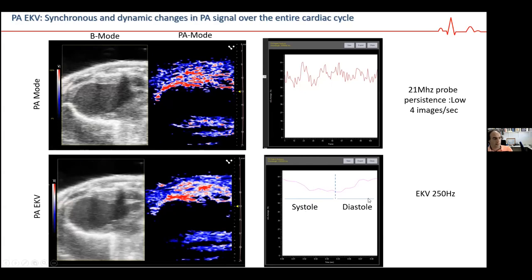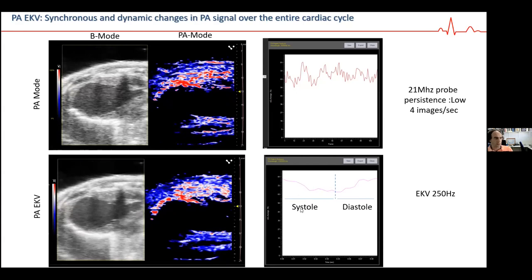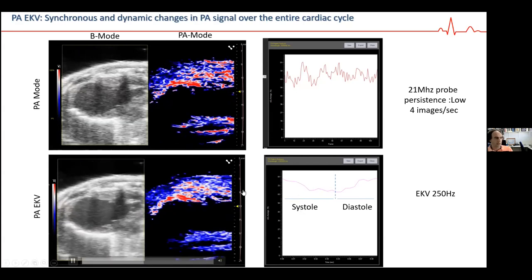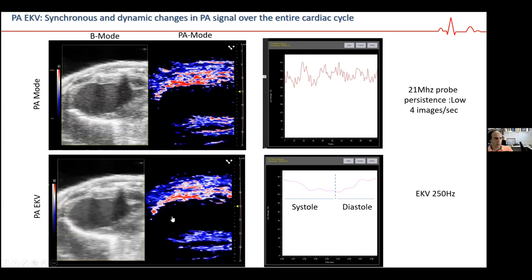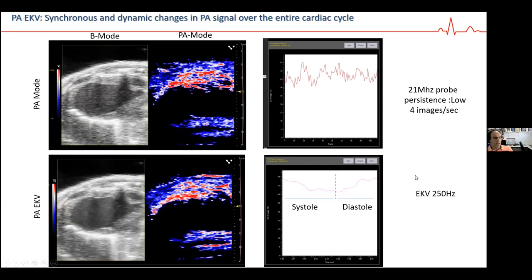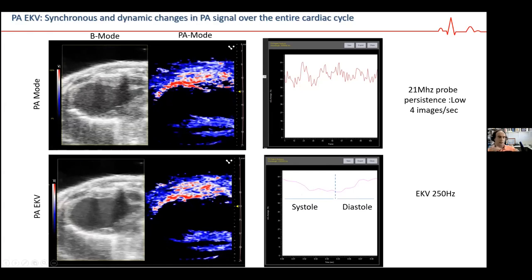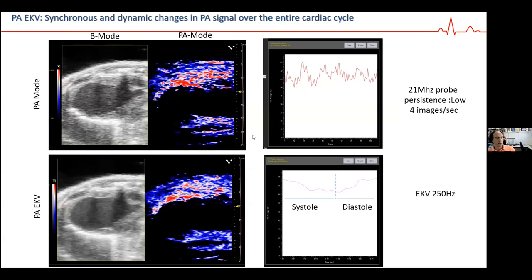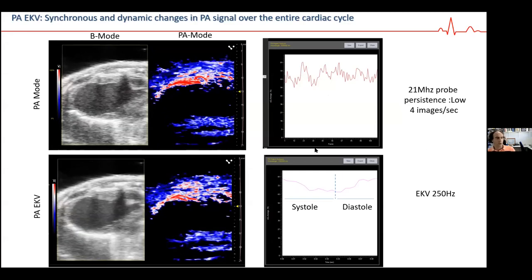At 4 hours, day one, and day seven, as expected, we see differences, a decrease in oxygen saturation in the whole anterior wall of the left ventricle. And it's interesting to say that this oxygen saturation is highly correlated to anterior wall myocardial strain.